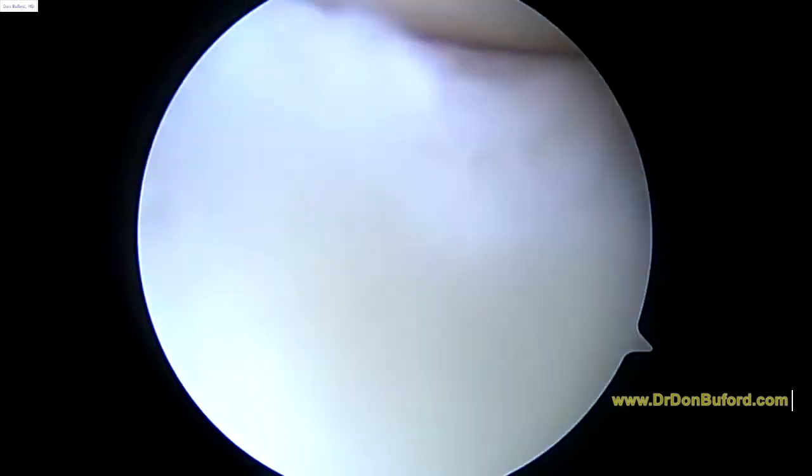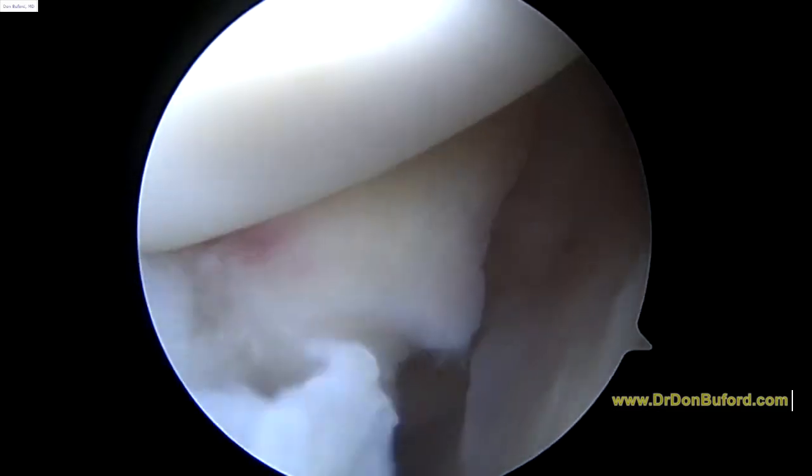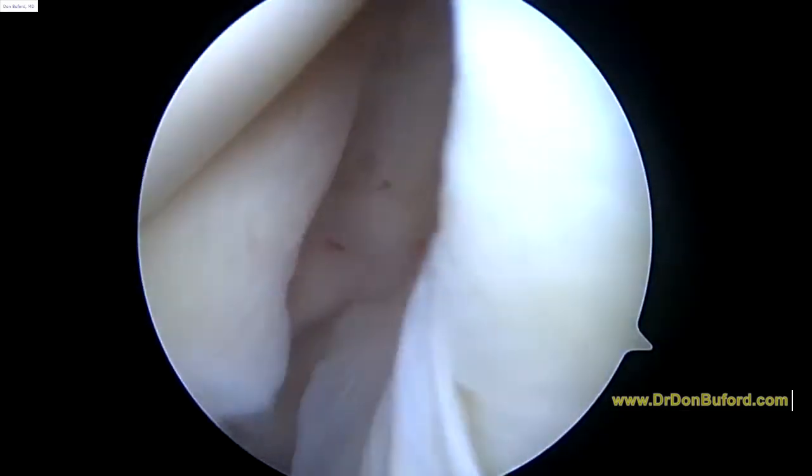We're going to get some work up above in just a minute. As you look down the front, that anatomy looks great down the front of the shoulder as well.